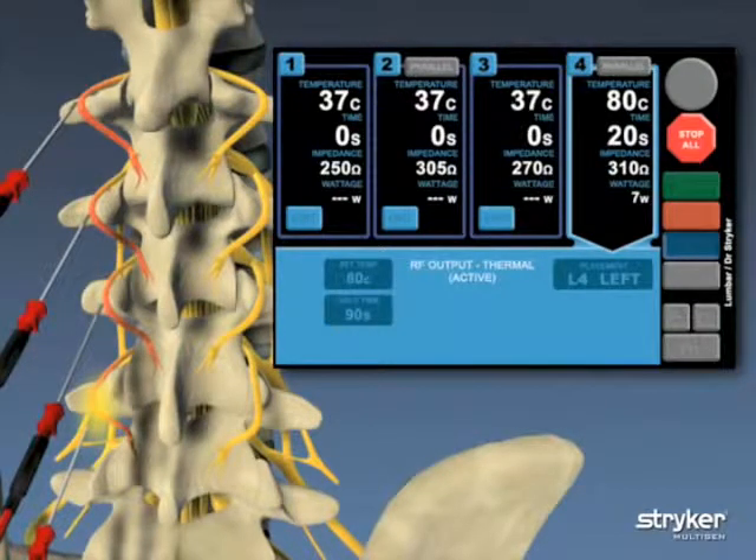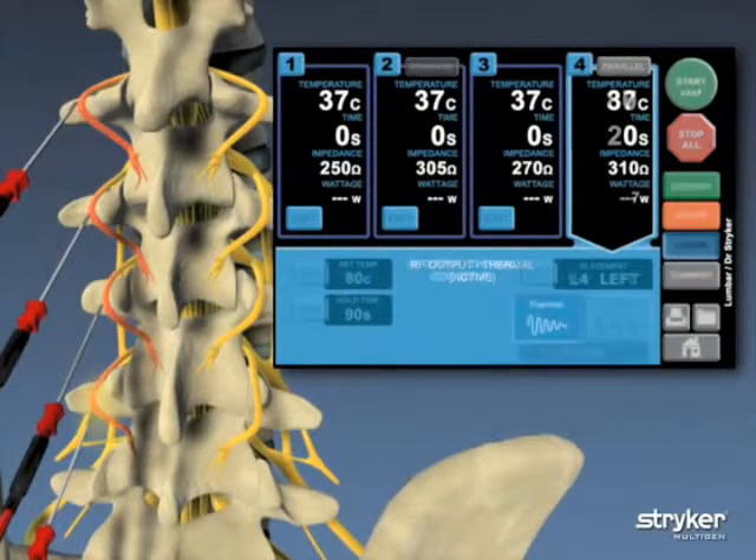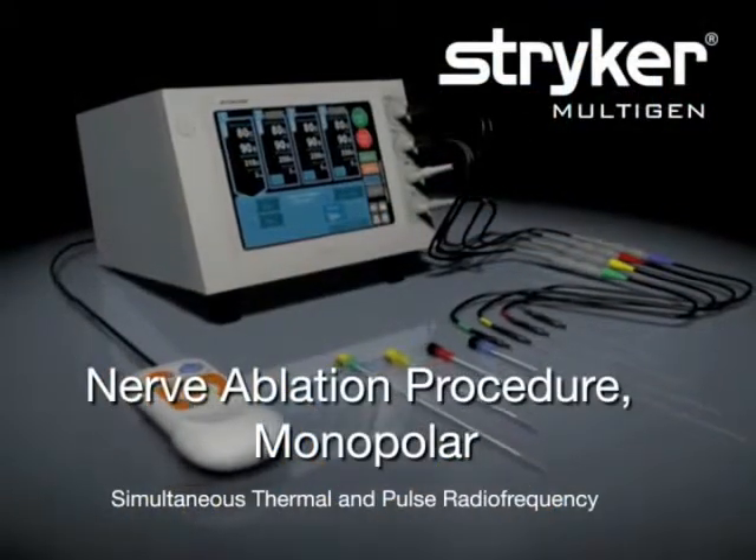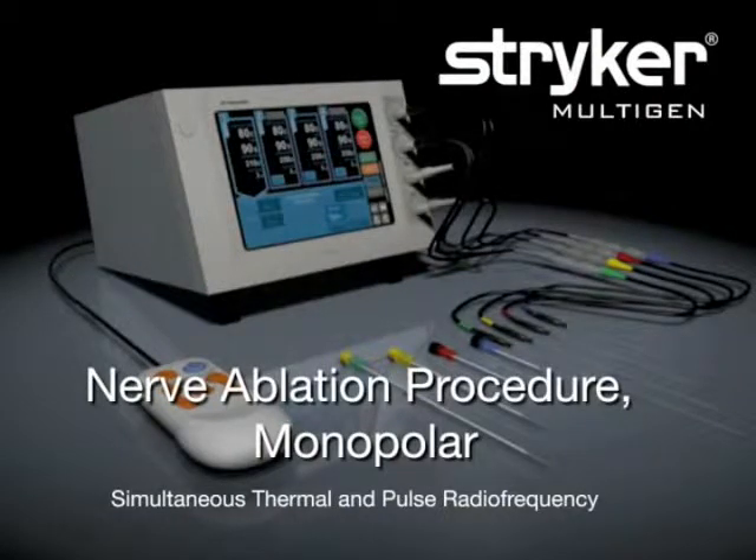After all lesions are complete, the screen goes back to its default settings. In this final demonstration, we'll use simultaneous starts in all four locations while performing pulsed radio frequency through needles one and two and thermal radio frequency through needles three and four.